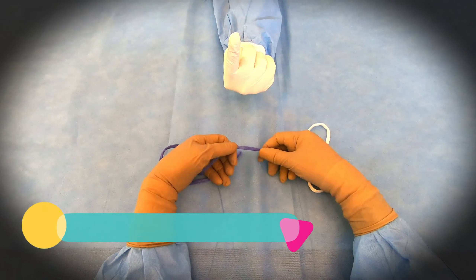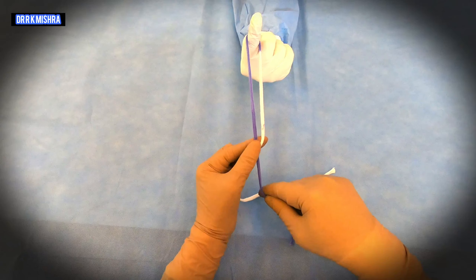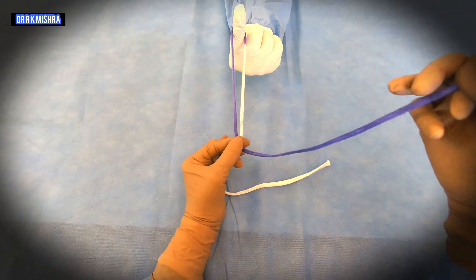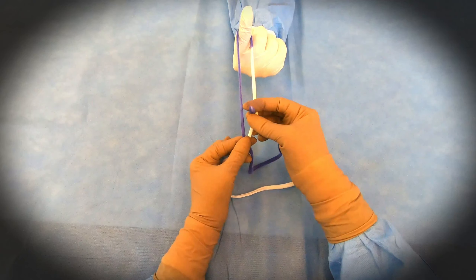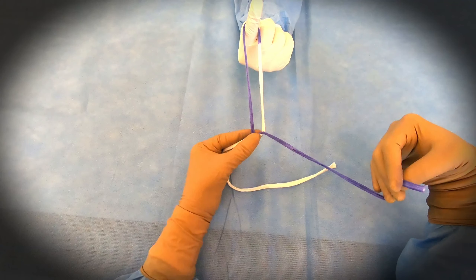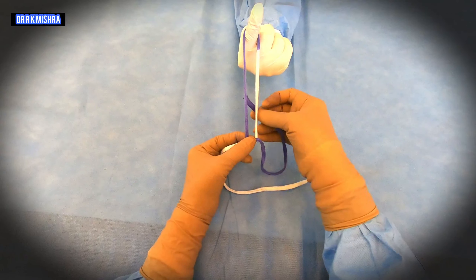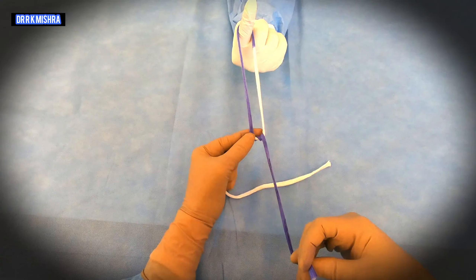You will ask the assistant for the finger and put the shorter over the longer, and then two hitches will be taken first. This is the first hitch, followed by the second hitch. So two hitches will be taken first.